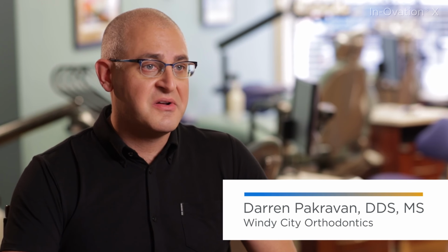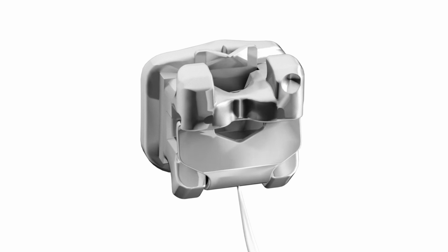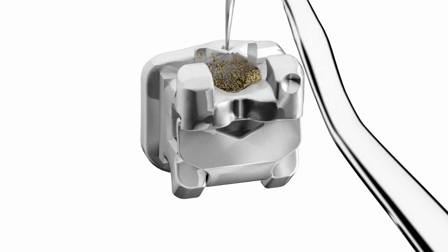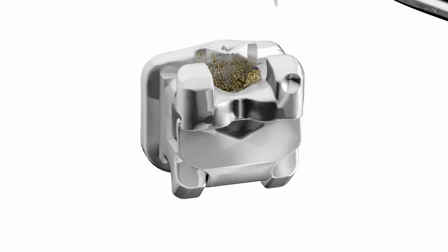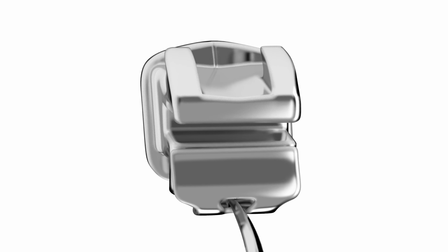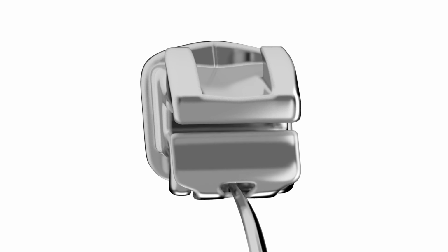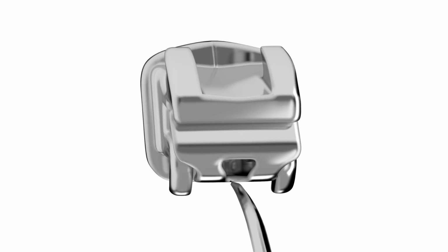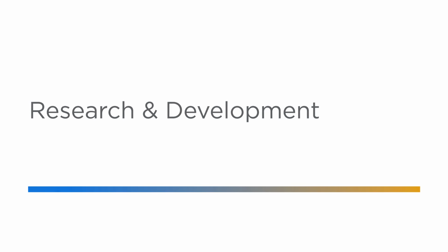If patients weren't keeping clean well, we'd start to get tartar and calculus buildup around the brackets. A big area for that would be around the gingival side of the bracket where we'd be trying to get at that clip. We closed that area so that calculus will not build up in there, so you can open and close the clip. One of the best changes I've seen in the new bracket is that it's opened from the incisal edge of the clip, which removes the temptation for people to do it the wrong way, but also removes most of the ability to do it the wrong way.